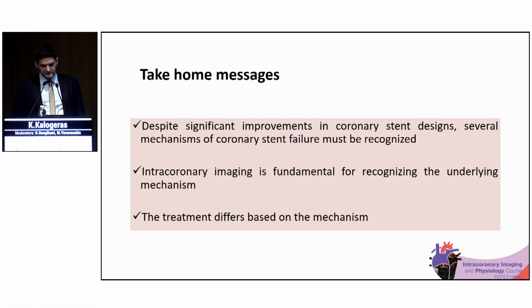So despite the significant improvements in coronary stent design, there are still several mechanisms of coronary stent failure, and we should be able to recognize these mechanisms. Intracoronary imaging is the most important tool we have to recognize the underlying mechanism, and based on that, we should plan the treatment options that we have. Thank you.